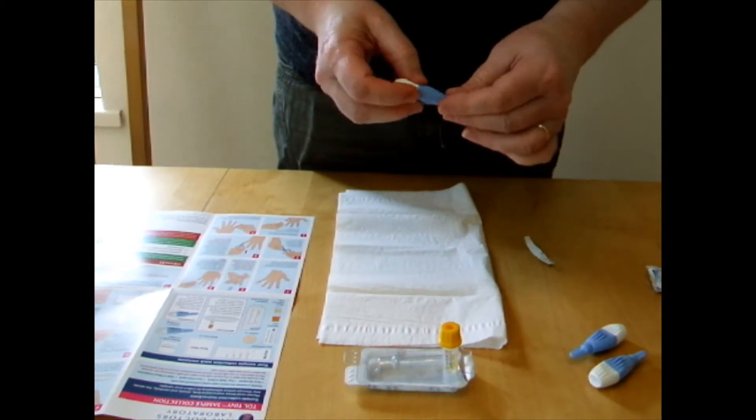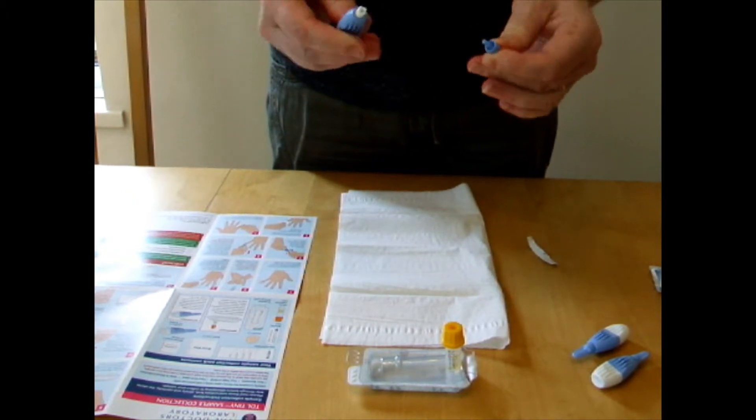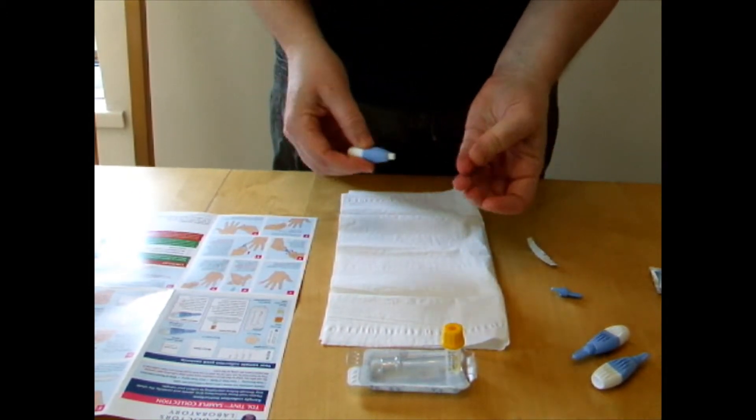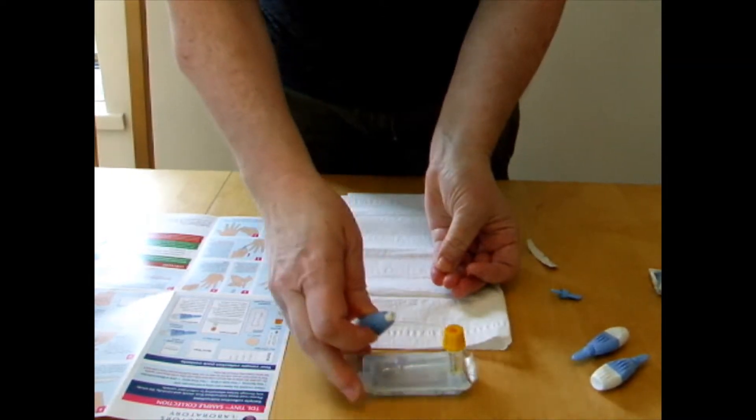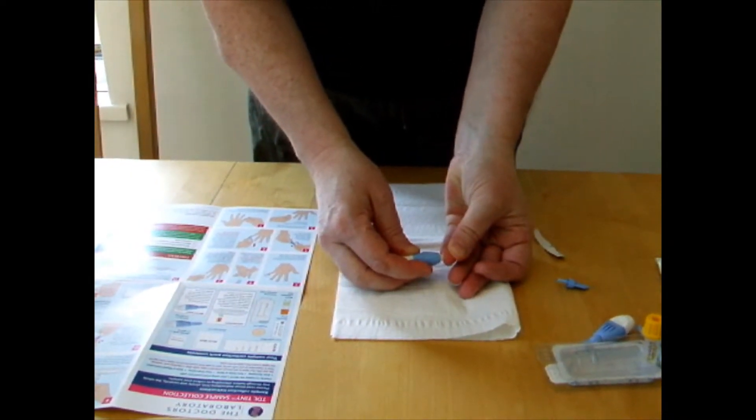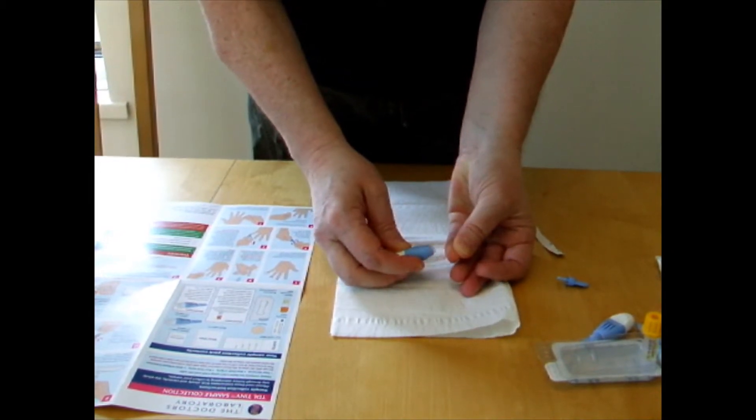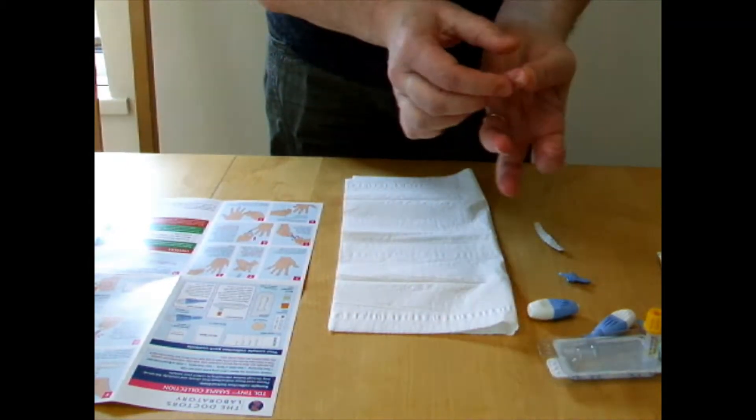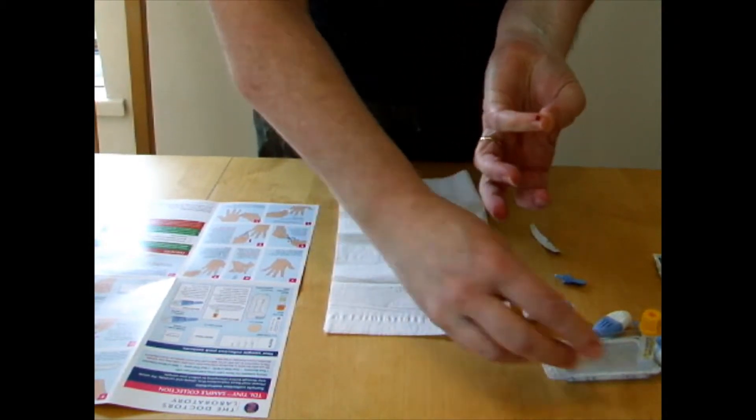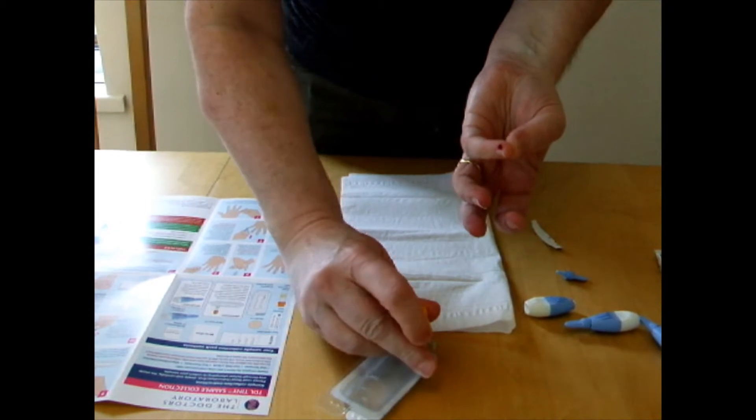Take the lancet and pull it out. You won't actually see the needle but there's a small needle in there and you're going to press on the side of your finger until it clicks and then you can see that you can get a nice flow of blood.